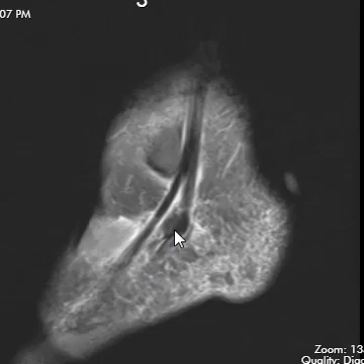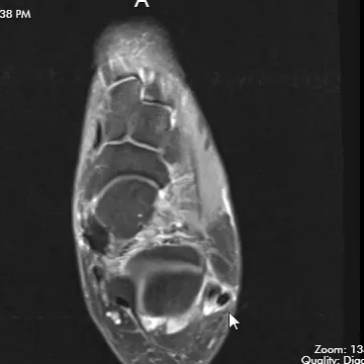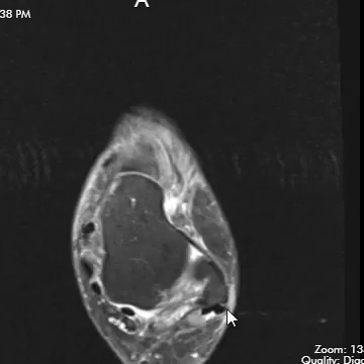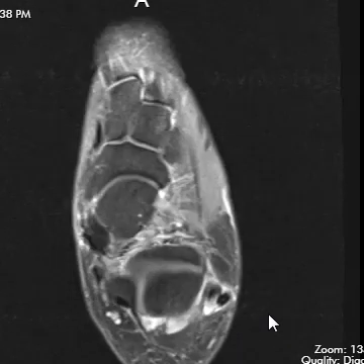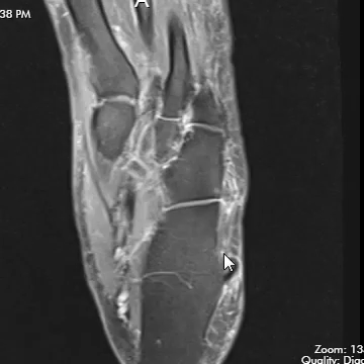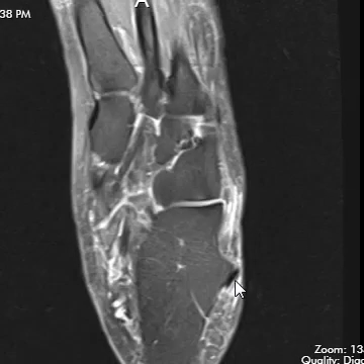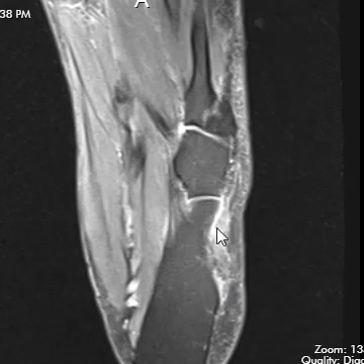Now we're going to look at axial images. This is with the toes up — the initial images. You see the peroneus longus and peroneus brevis, and this is the lateral malleolus. As we go inframalleolar, the peroneus brevis tendon pretty much disappears because of the magic angle phenomenon. The peroneus longus tendon is visible until the peroneal tubercle, and then below that it also disappears.